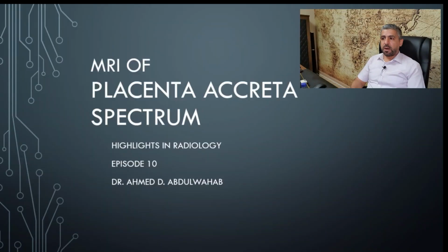In fact, I chose this topic because one of my very respected colleagues suggested that we do an episode on it. So I might take a little bit more than usual of your time, but I would recommend that you see this episode till the end because of its clinical significance. Today we are going to talk about the MRI of placenta accreta spectrum.